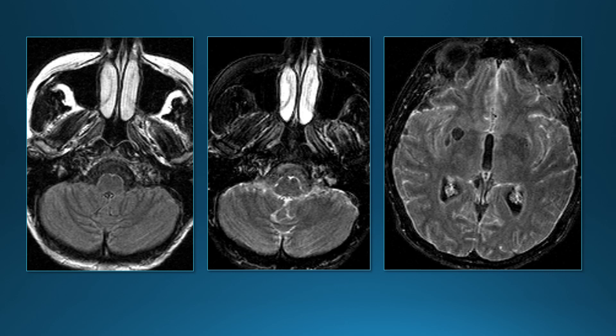These are pre- and post-contrast FLAIR images. The post-contrast FLAIR images are probably the most sensitive for leptomeningeal enhancement. We can nicely see the enhancement within the sulci — they turn white on post-contrast FLAIR, again along the brain stem. Overall, post-contrast FLAIR is probably going to be the most sensitive for leptomeningeal enhancement.